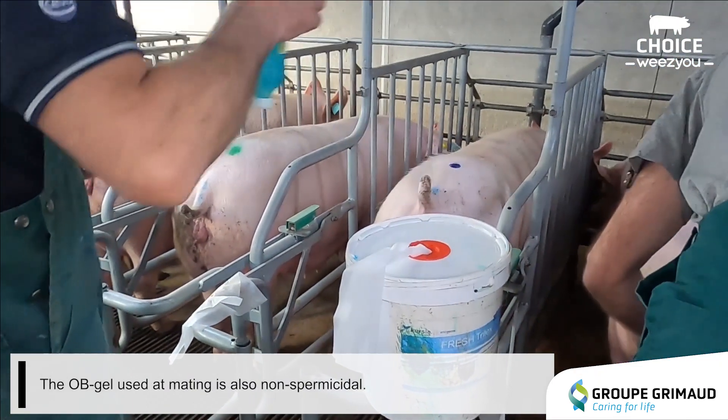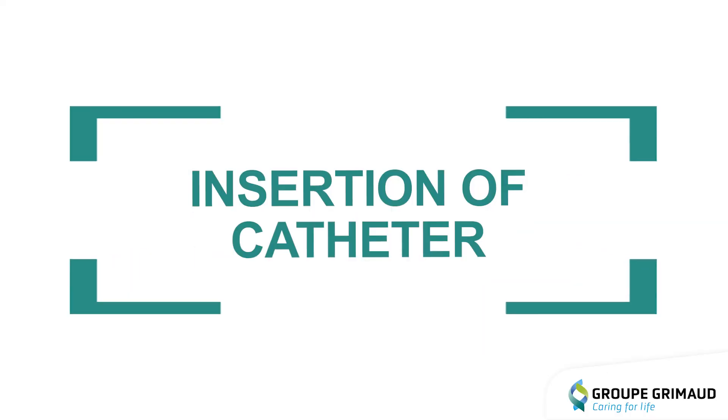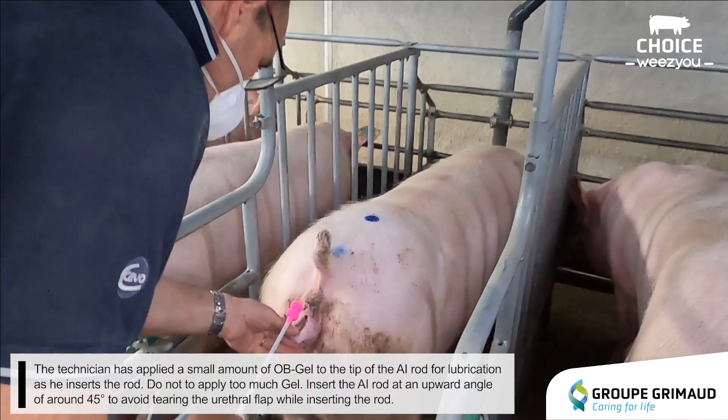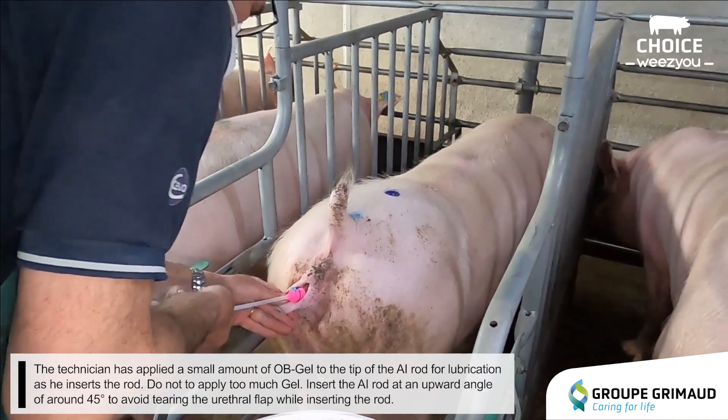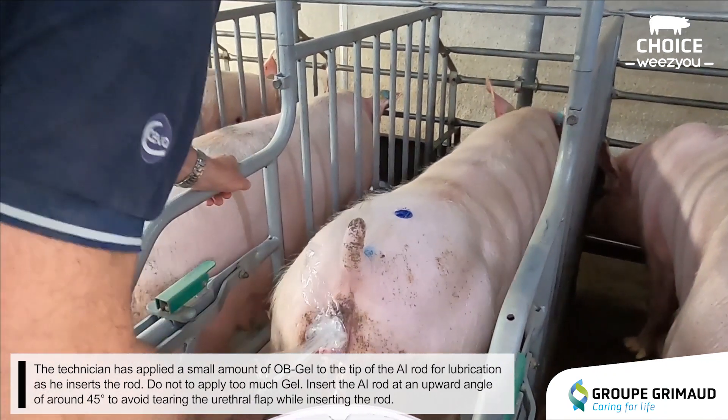The OB gel used at mating is also non-spermicidal. The technician has applied a small amount of OB gel to the tip of the AI rod for lubrication as he inserts the rod. Do not apply too much gel.